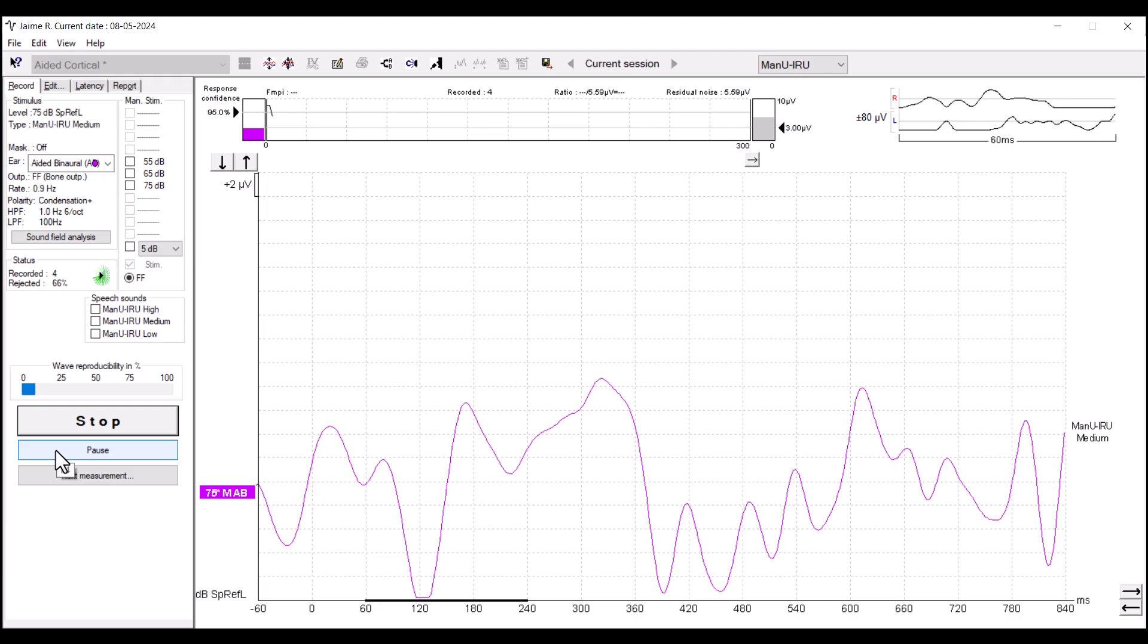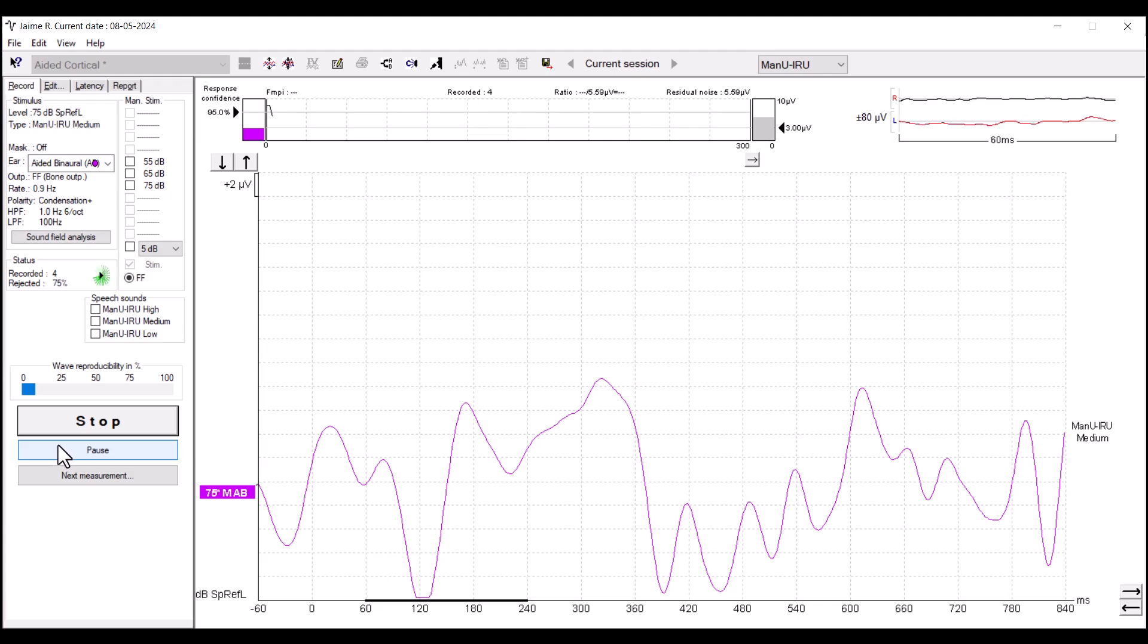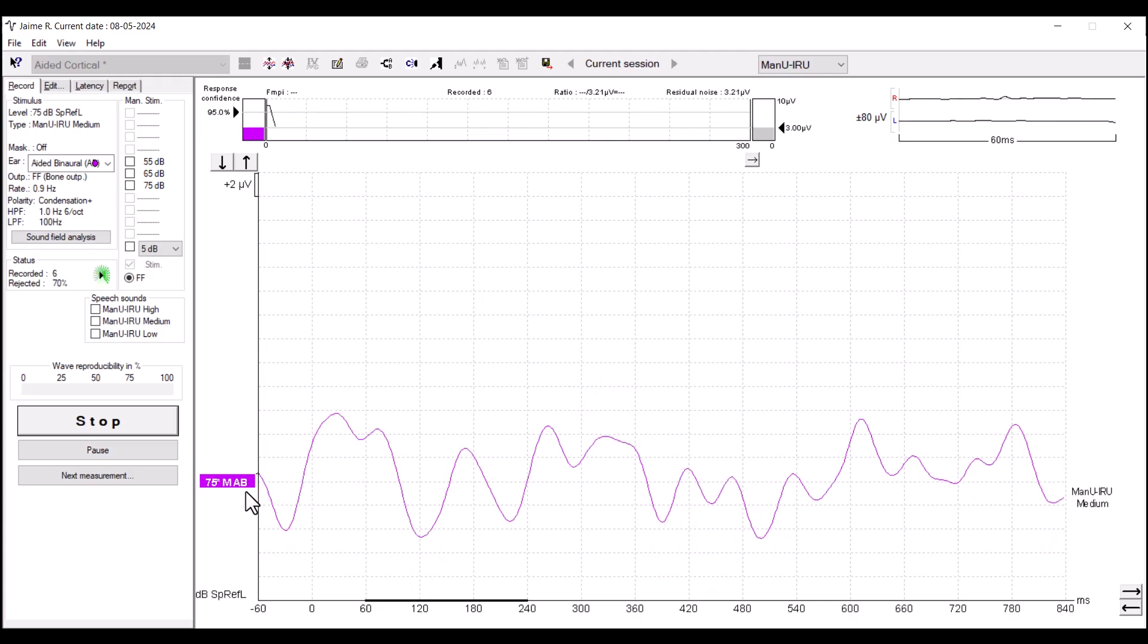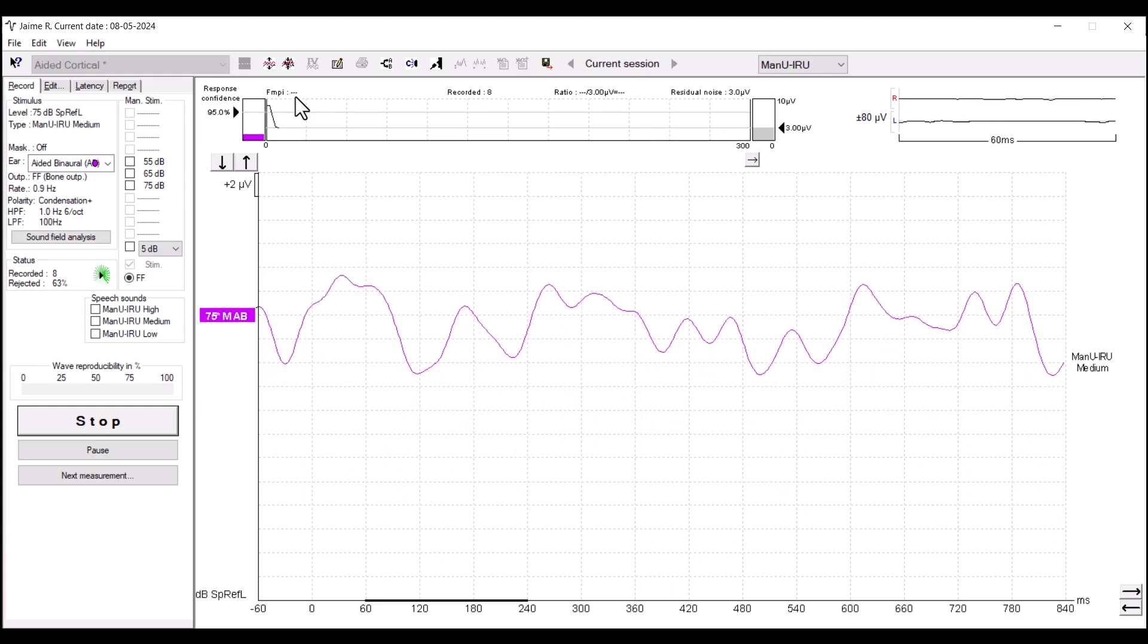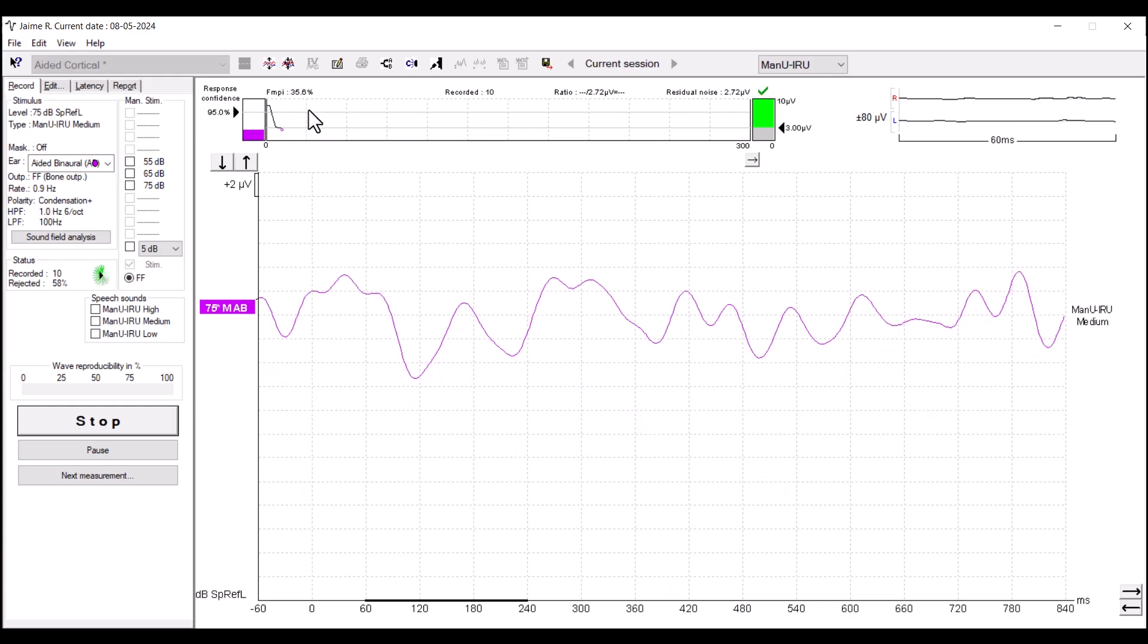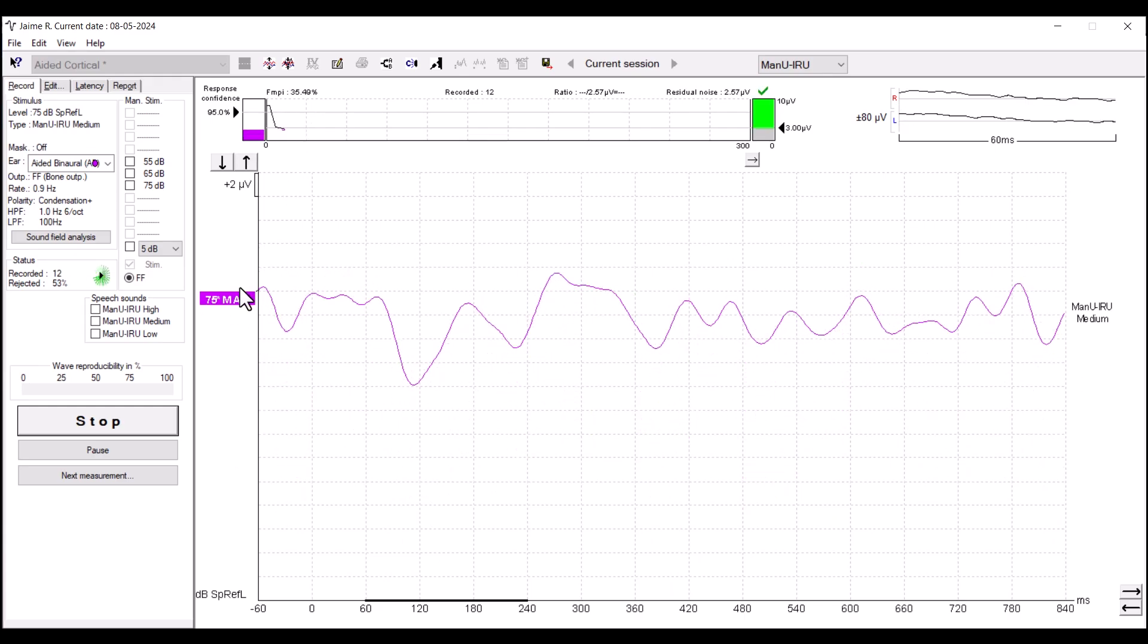The waveform will appear on the software screen. You can refer to the FMPI and residual noise calculator at the top of the screen to help decide when to stop testing once the waveform has stopped recording.